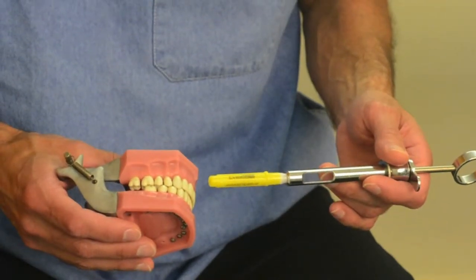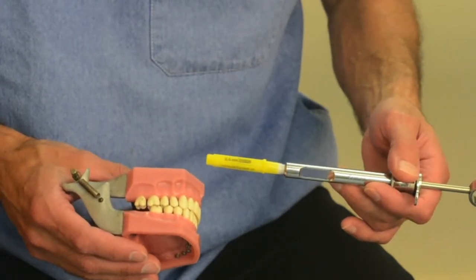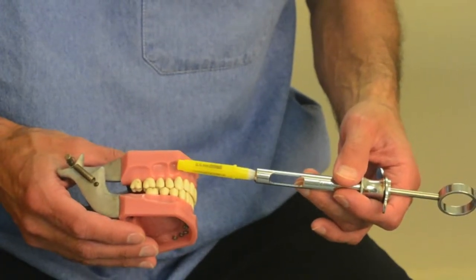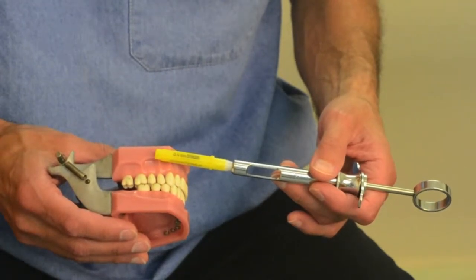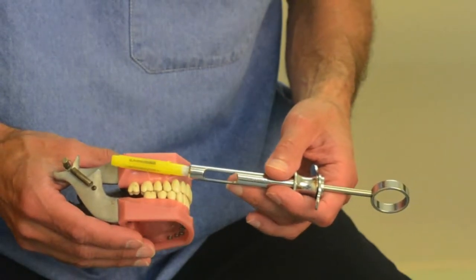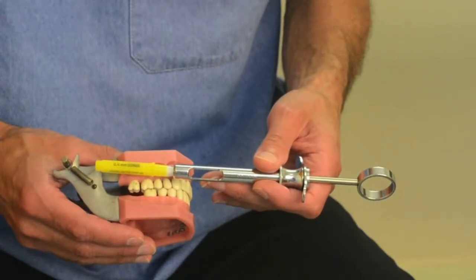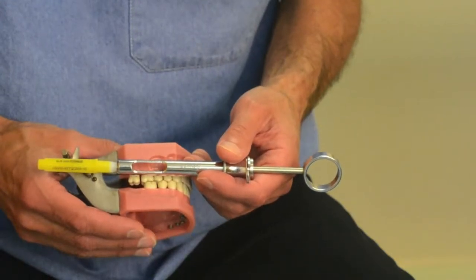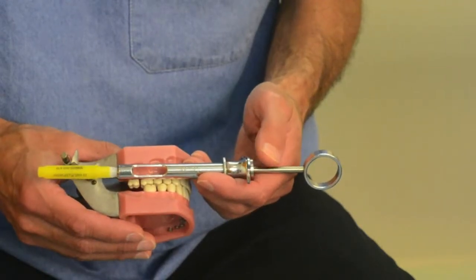The Akinosi injection technique is a closed mouth mandibular block injection given by having the patient go into full intercuspation, then inserting the needle close to the maxilla at the level of and parallel to the mucogingival junction of the maxilla. The needle is inserted posteriorly and angled so that it goes medial to the mandibular ramus, then pushed in as far as it will go until the body of the syringe abuts up against the ascending ramus of the mandible.